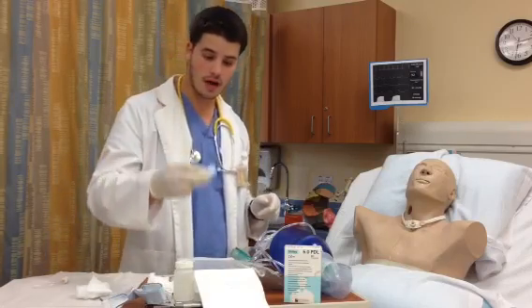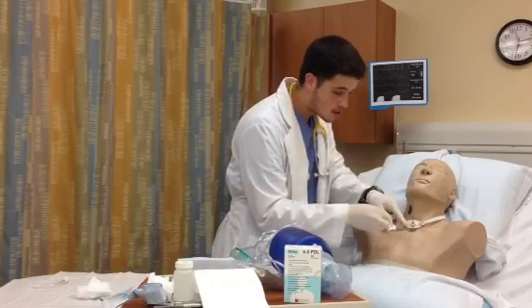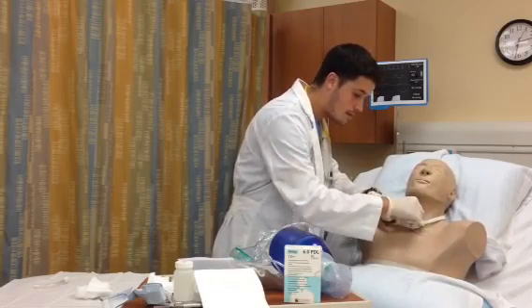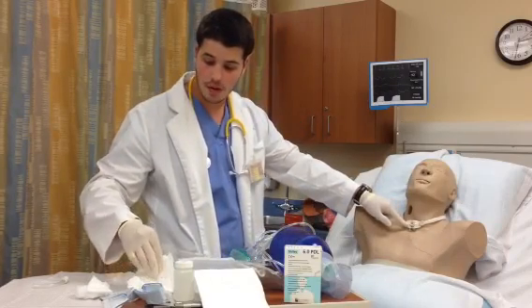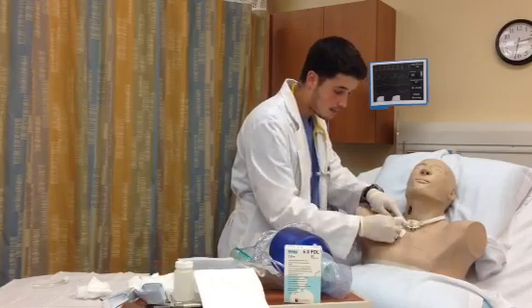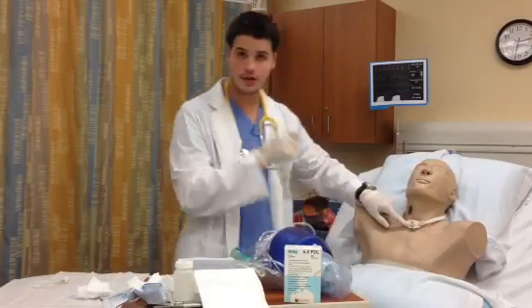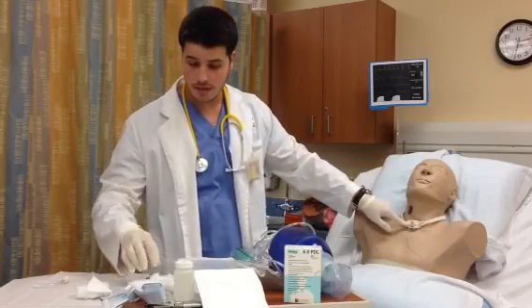I'm going to get a 4x4 gauze, dip it into the hydrogen peroxide, clean around, make sure you hold on to his flange so it doesn't come out, clean around it. Then I'm going to get another gauze, dip it into the sterile water, and just clean again. And we're going to get one more to dry, holding his flange. We're always going to keep a lookout at the vitals and make sure he's stable.